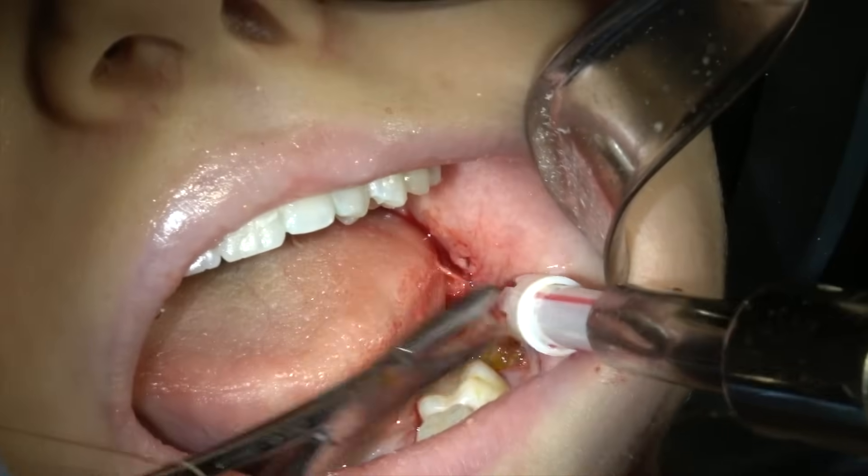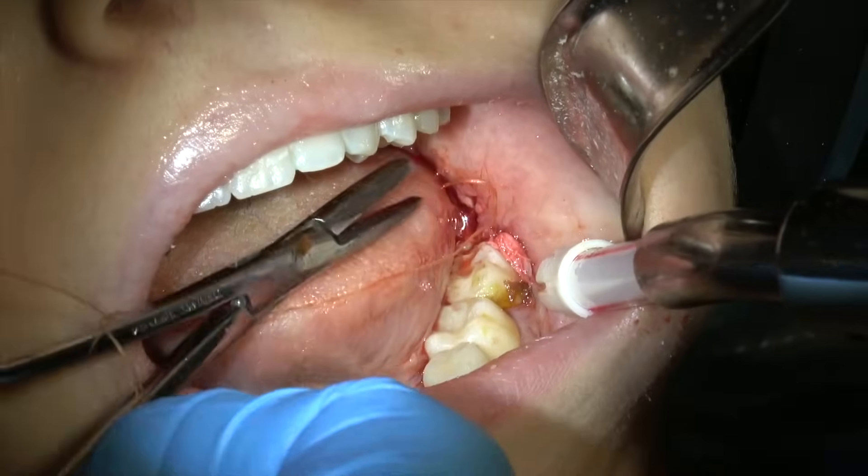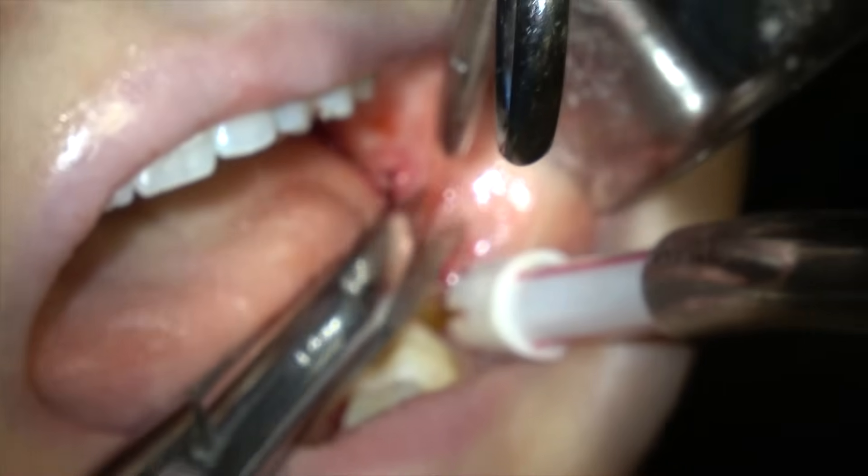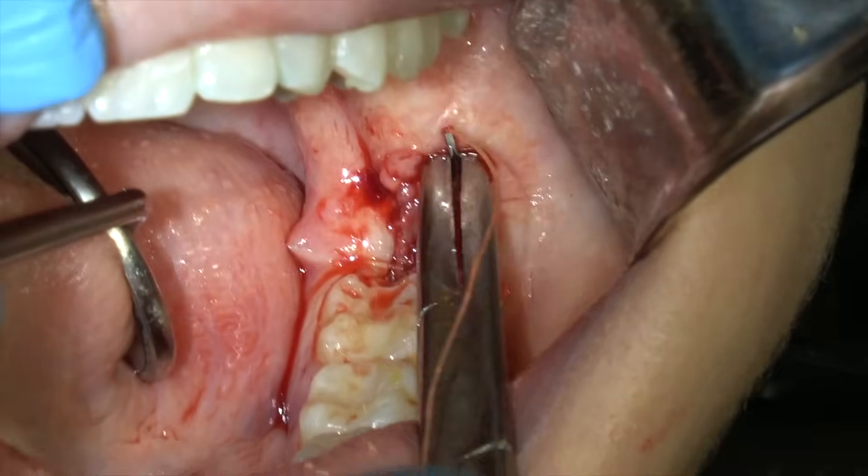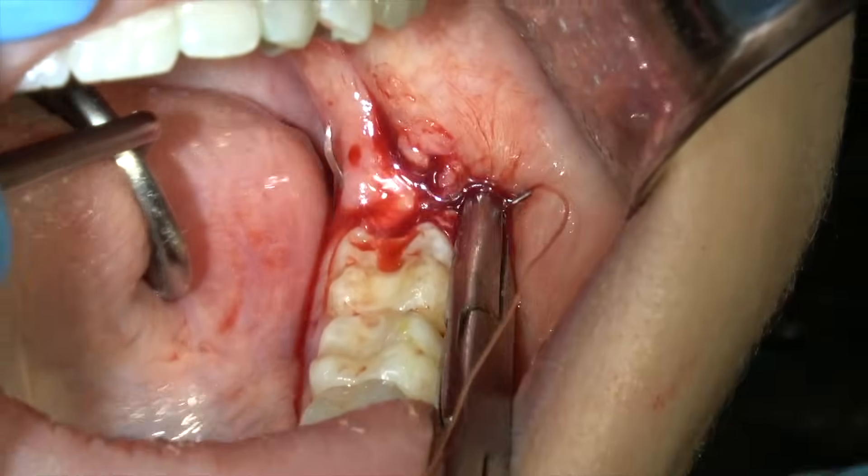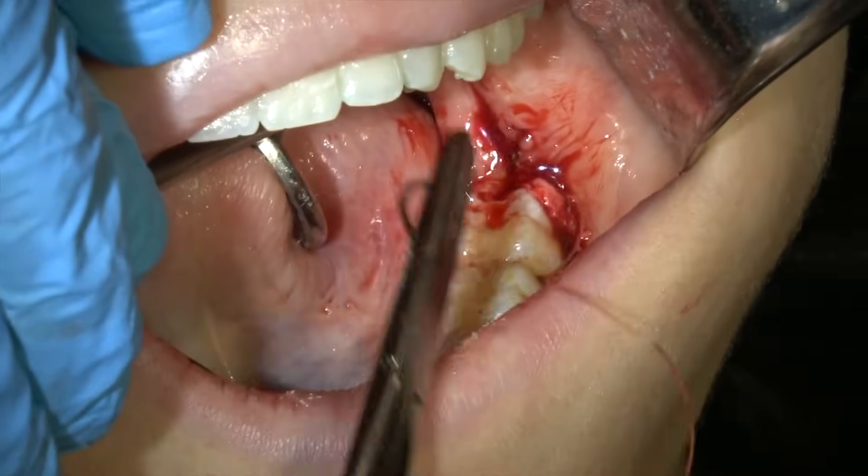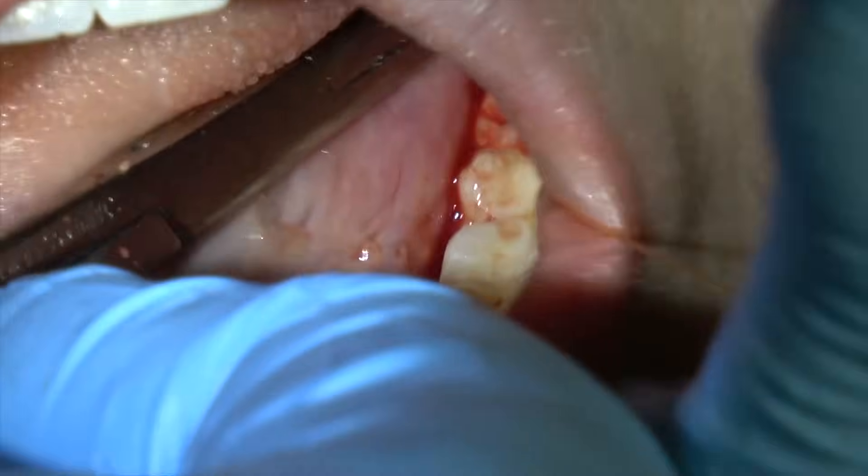Normally I just place one suture for a maxillary wisdom tooth, but I quite often place two for a mandibular. You can see now I've gone back about mid-incision. And again, take a big bite. If you don't, the suture will pull out, will pull through. So the main thing here is you want to be very conscious of the inferior alveolar nerve.